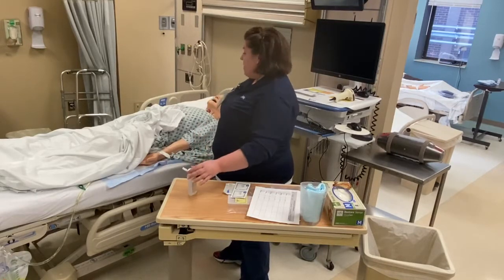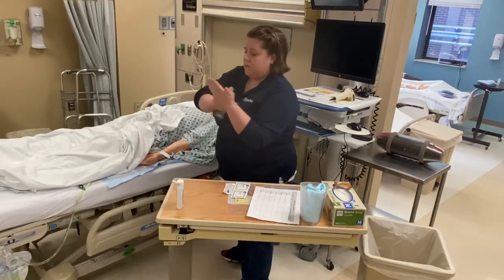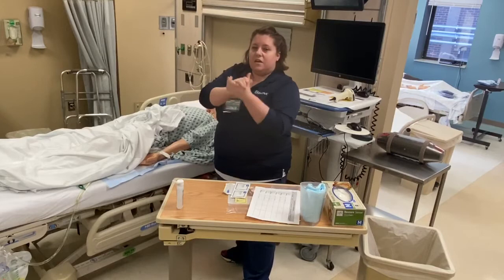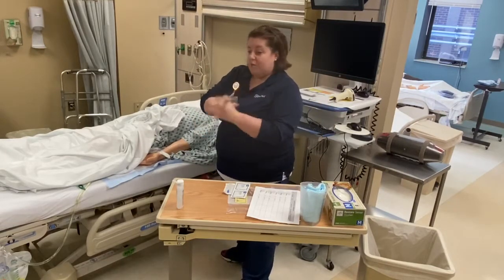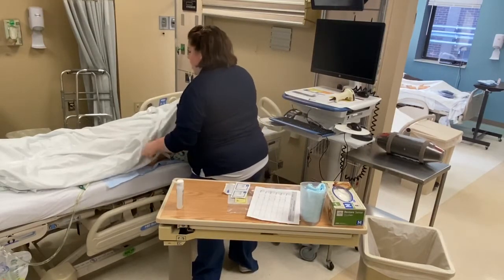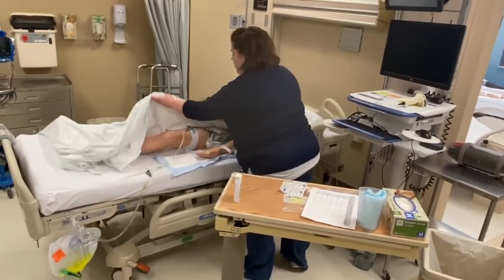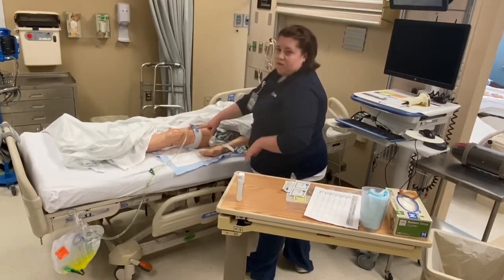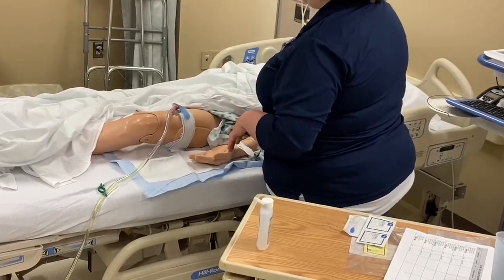Okay, at this point, since I touched the patient, I'm gonna wash my hands. And I'm gonna prepare to do my sample. I wanna make sure I pull the curtain to provide privacy. All right, so Miss Muhammad, I need to pull your sheet back just a little bit so I can get to your Foley catheter. With this procedure, I only need to get to the port area right here on the catheter, so I don't need to fully expose her. I just pull the sheet back as much as I need.